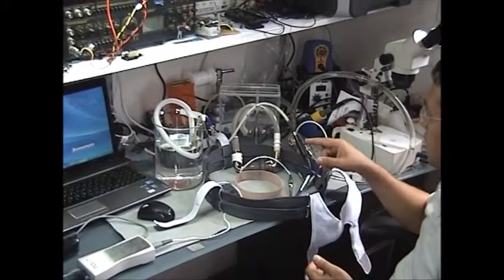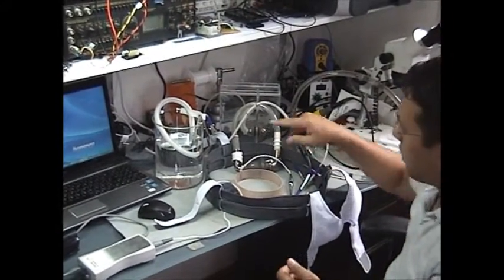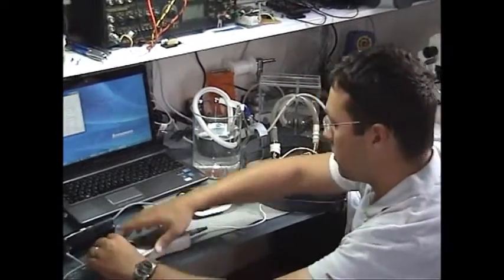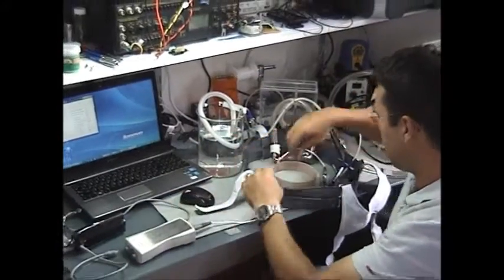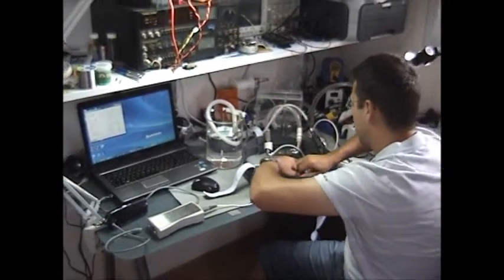I will now change the VAD. I will connect the Jarvik Pediatric VAD.